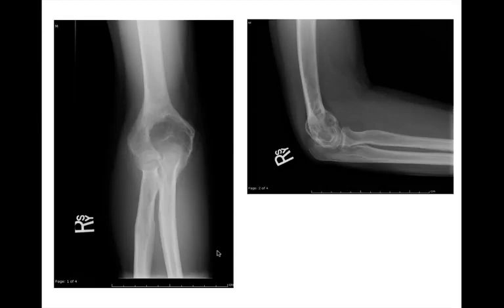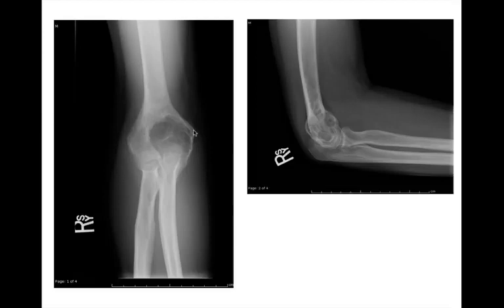We already saw this case — the chondroblastoma from earlier. This is a geographic lytic lesion, narrow zone of transition, non-sclerotic border, eccentrically located in the epiphysis and metaphysis of the distal humerus. Harder to see on the lateral view. This was the chondroblastoma. Remember, chondroblastomas are epiphyseally located or epiphyseally based lesions.